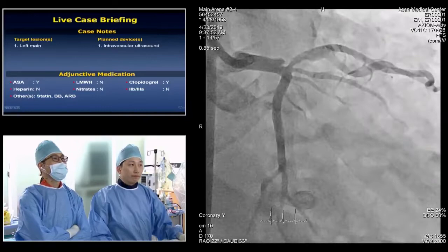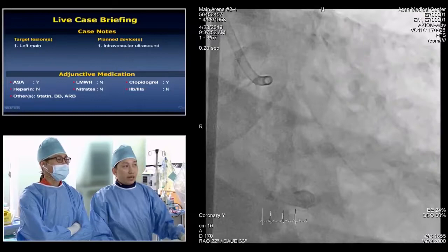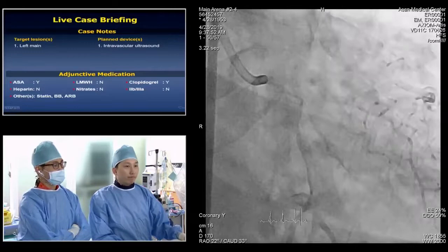Well, I think there's a significant mismatch in the size of the LAD and left main. I think that will be the biggest challenge in this case. Right. So it's a bifurcation too, with a discrepancy between the LAD and the left main. So we have to use IVUS to confirm the real size of the LAD and the left main. Yes. Thanks for your opinion.